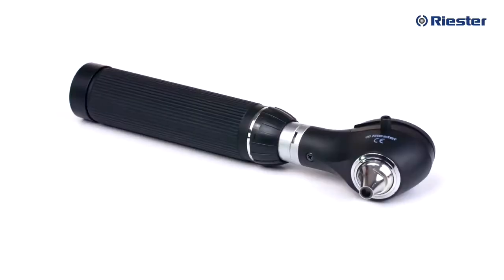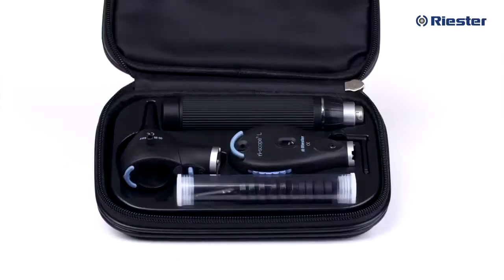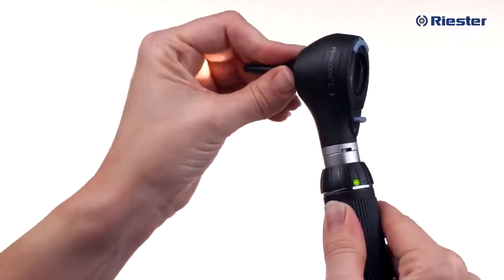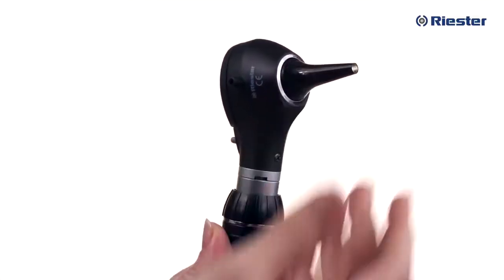Let's look at the standard otoscope L3 model. A unique feature of the Riester RiScope otoscope is the built-in throat illuminator. With the otoscope turned on and no specula attached, you will notice the fully integrated fiber optic throat illuminator — it's in the shape of a ring. To prepare the otoscope for use in the ears or nose, you will need to attach a specula. Simply press the specula onto the specula fitting, which is a silver fitting integrated into the otoscope face.